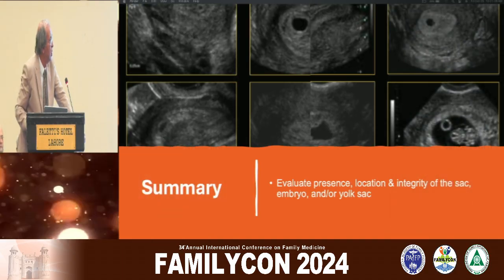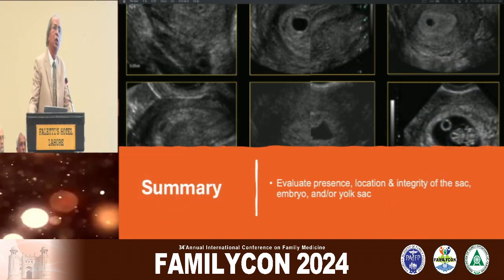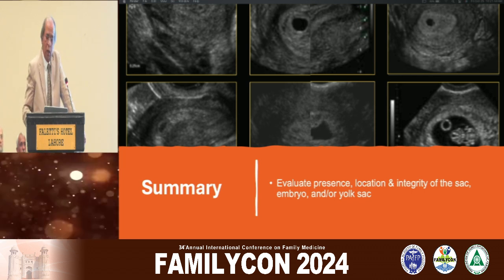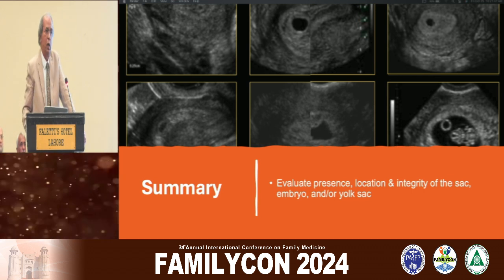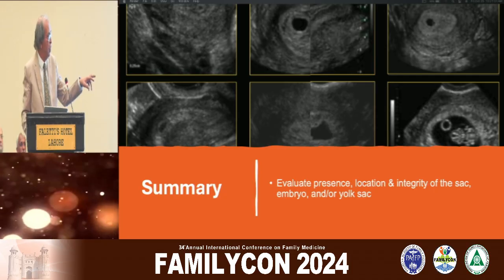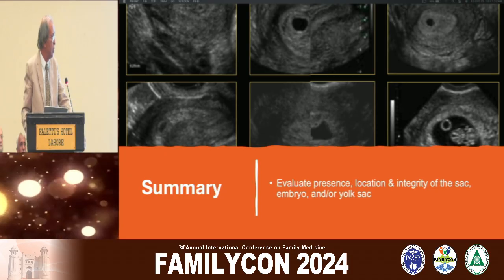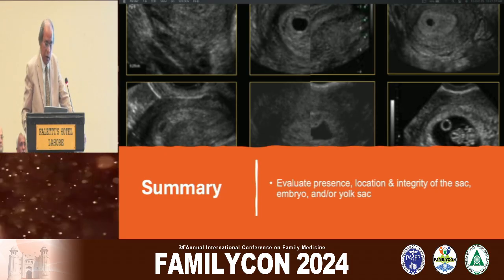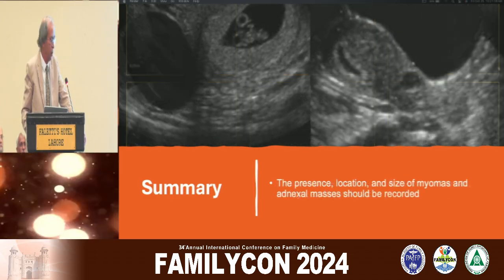So the summary is that we should evaluate all these very systematically so that we don't miss anything. We should go for the normal structures, and for the normal pregnancy, evaluate for the presence and location, embryo and yolk sac, and also a detailed anatomy scan. Thank you very much.